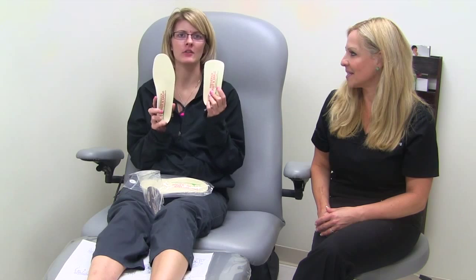To break them in, you remove your inner soles from your shoe and place these in your shoes. The best thing about these orthotics is they come at full length and three-quarter length for your special needs.